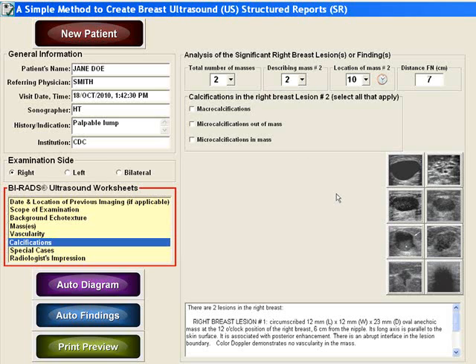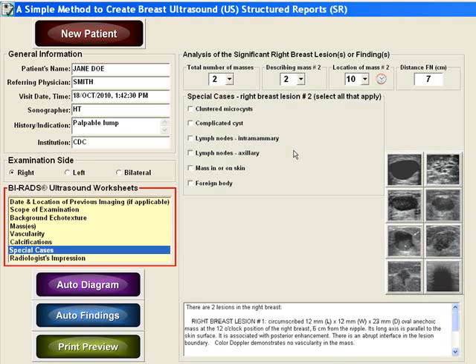Describing calcifications is optional — choose all that apply. Describing special cases is also optional. Again, choose all that apply for each mass.